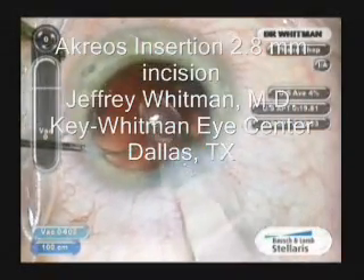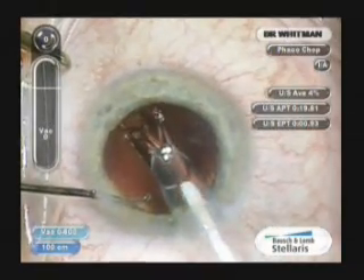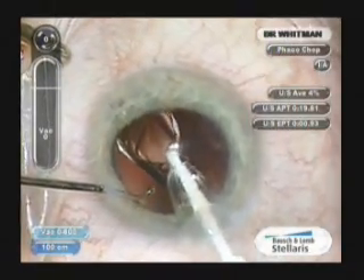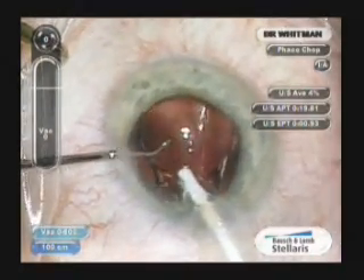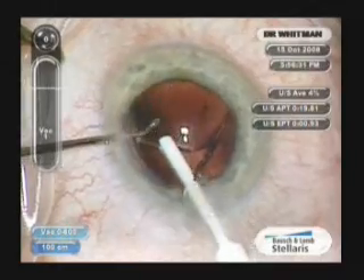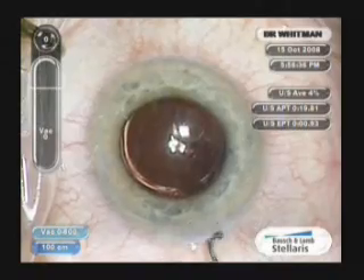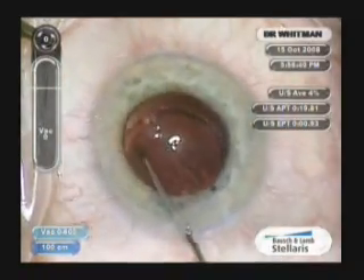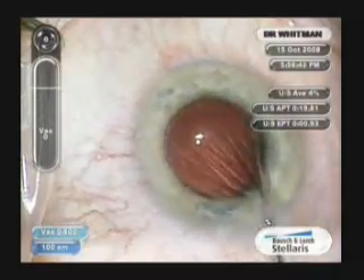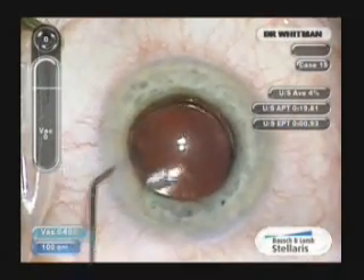This video depicts the insertion of an Acryos acrylic lens implant into the bag through a 2.8mm incision. The inserter allows it to be injected really effortlessly and it unfolds very nicely. You can see it self-centers really without difficulty.